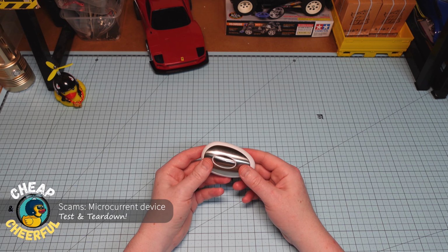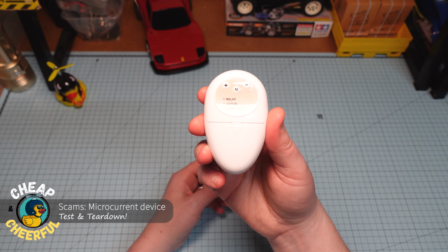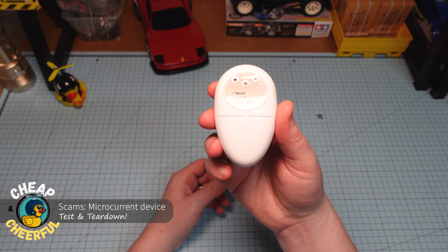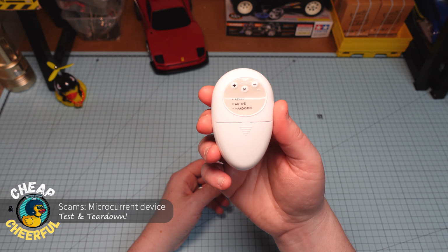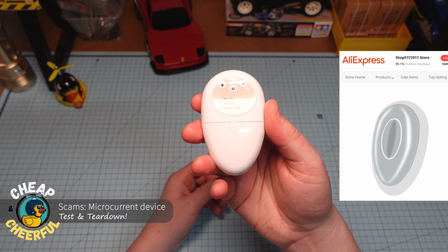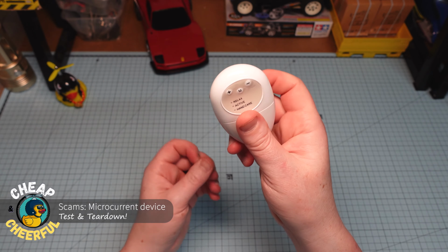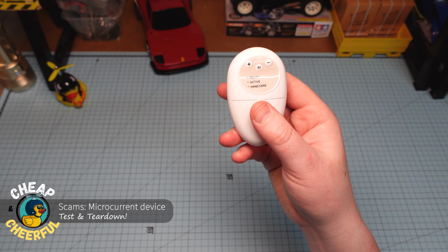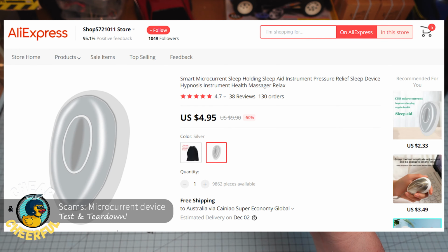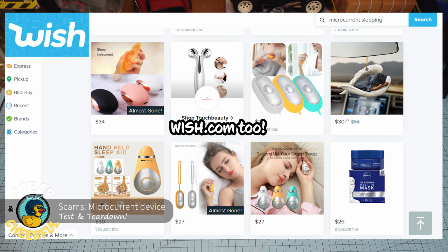Everybody. Today I'm looking at this strange little device. Probably wondering what on earth is that? Exactly what I thought when I saw it listed on AliExpress, and that's exactly why I had to get it. So this is a microcurrent device that are sold extensively on AliExpress in many different shapes and sizes.